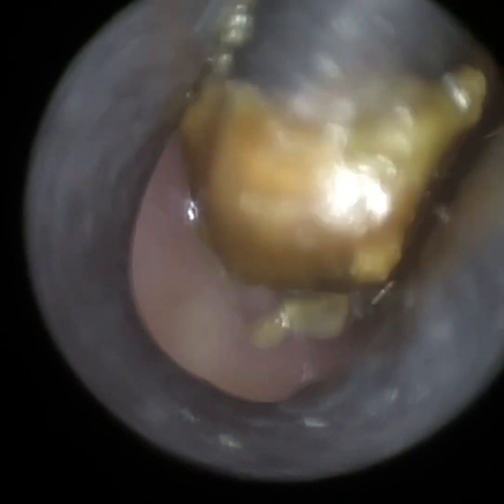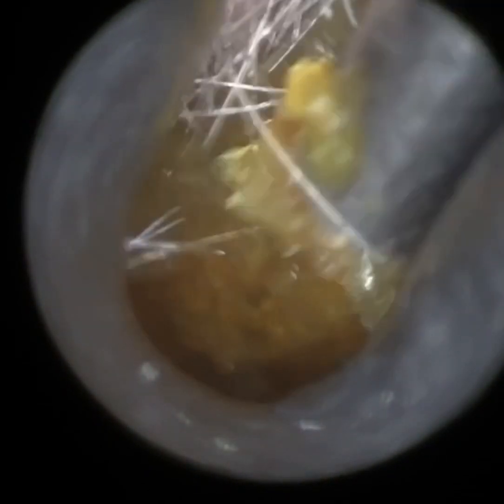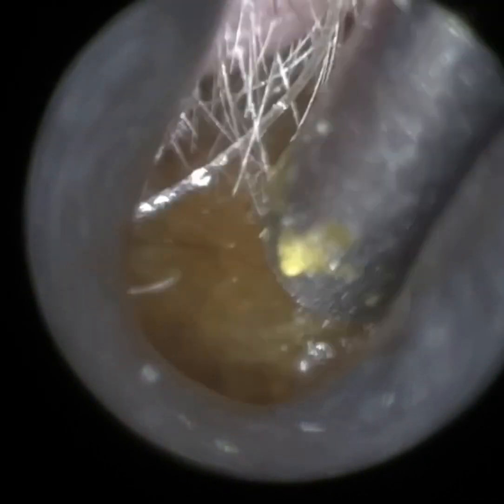I've just put some olive oil spray in here just to change the consistency and bind the wax plug together, and you can see I'm getting a much better suction grip and I'm just retrieving this wax plug out of the ear. The entrance is a bit narrower, so as the speculum is withdrawn from the ear the entrance does narrow a bit and closes upon the wax plug, kind of seizing it, trying to trap it inside the ear — but we just managed to wriggle this out.